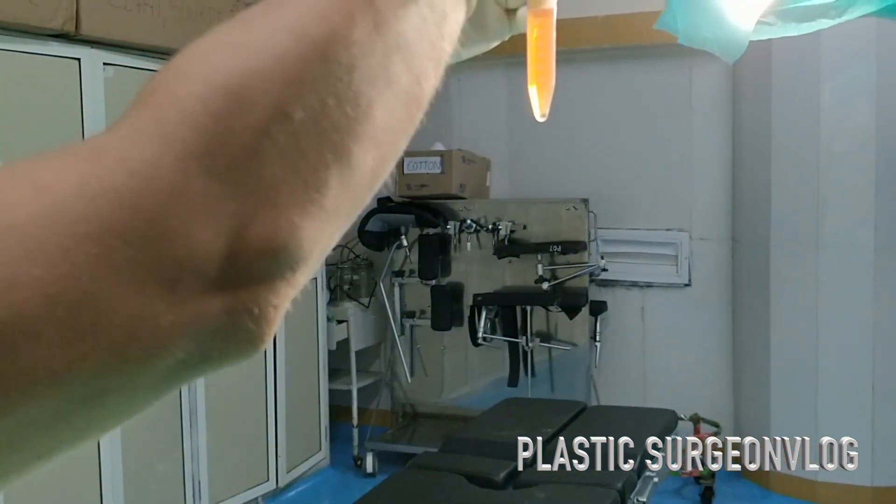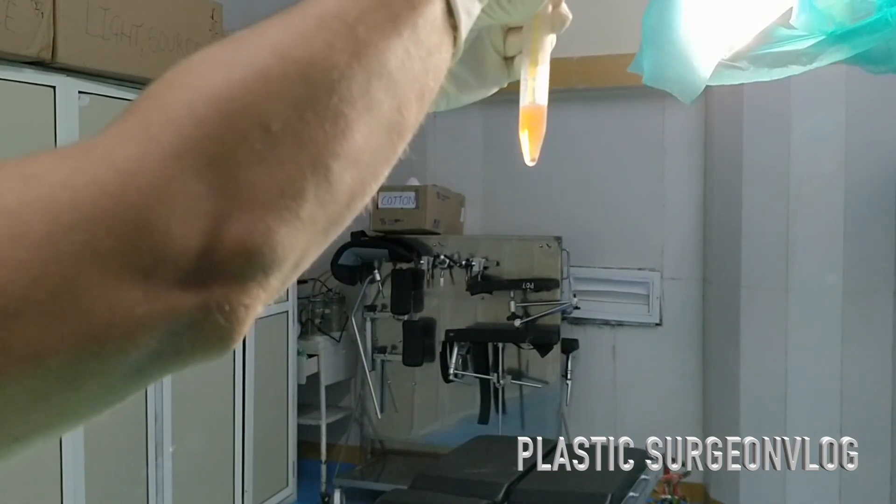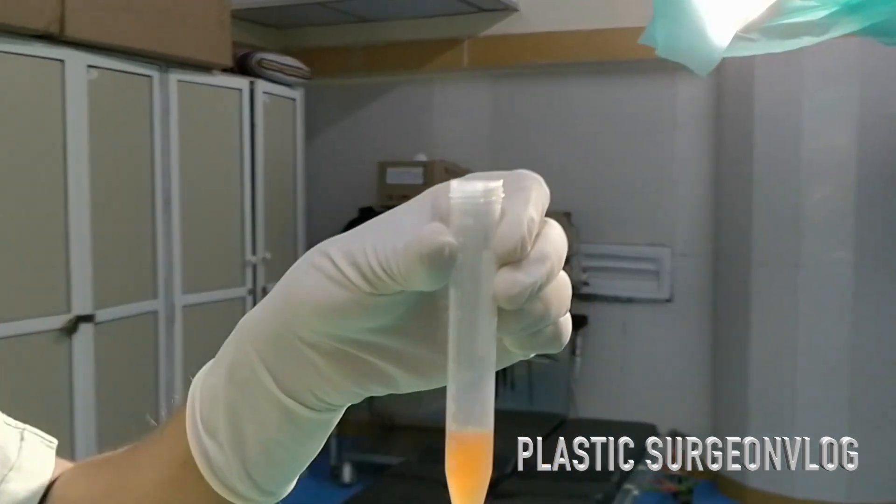Here I am discarding the upper layer of this solution, which is the platelet poor plasma, and I am collecting the lower layer, which is the platelet-rich plasma.